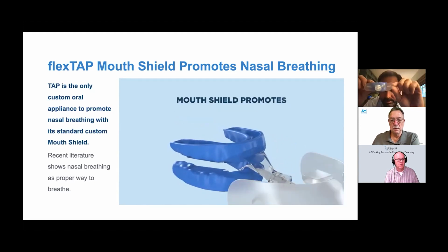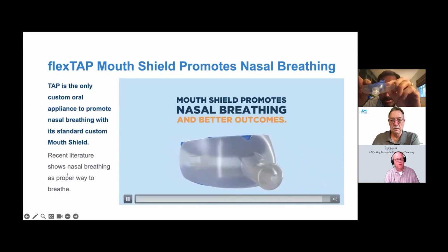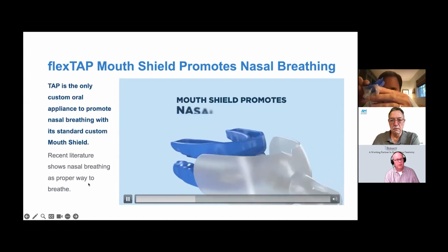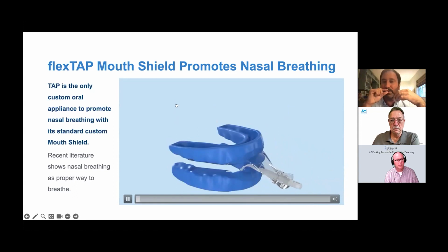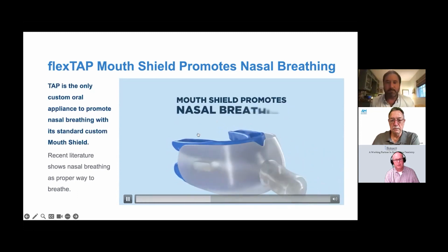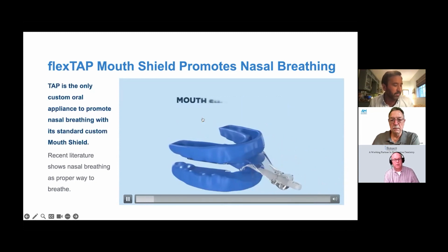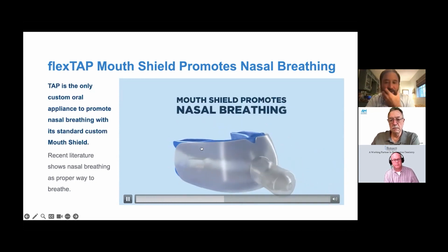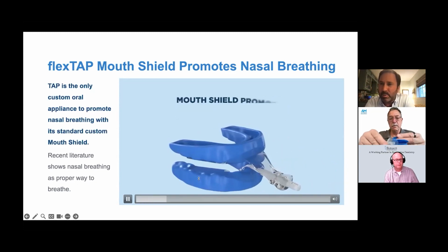But another thing is that these flanges can be trimmed down as well. I've trimmed mine before, these posterior pads that Steve was referencing earlier, where it's just covering right where my lips are slightly open with the device. So that's another thing, these are customizable. You can trim them down based off of the patient's lip opening size. But I don't know. Do you have any other pointers there, Steve?